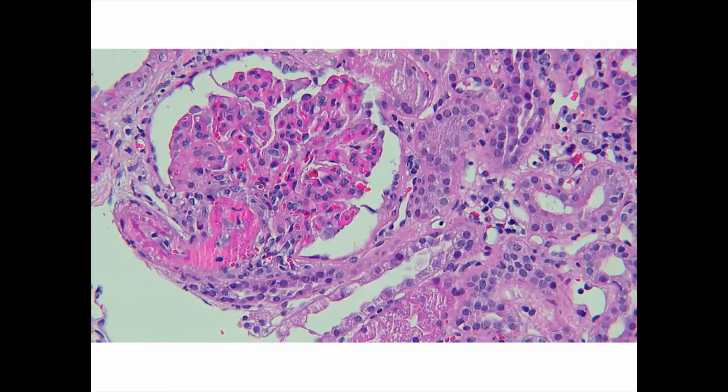But sometimes we have to make a decision on the H&E whether this is a crescent or not, because this particular glomerulus might get cut out, and there may be no other glomerulus with this pathology.